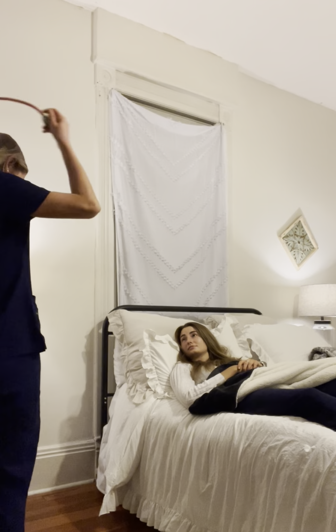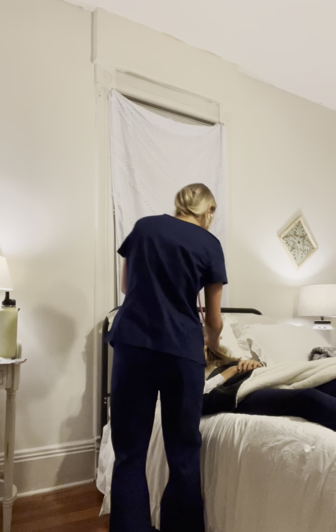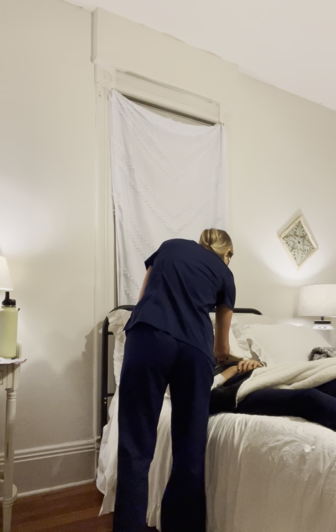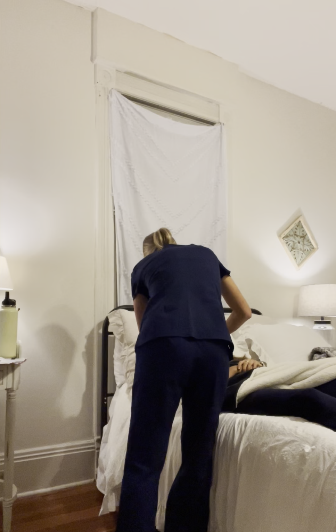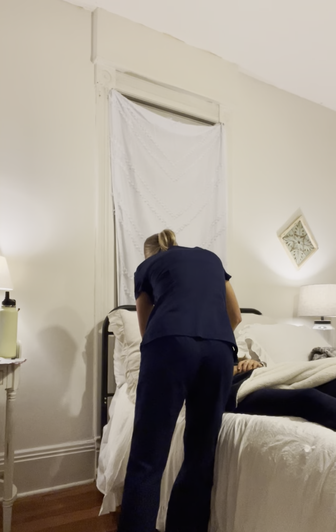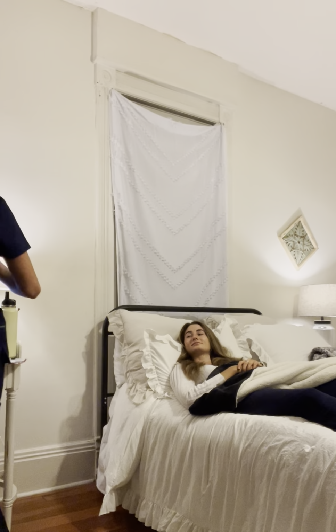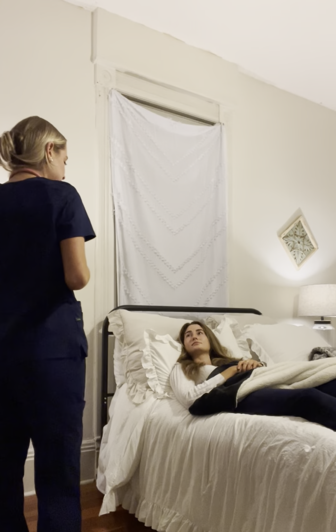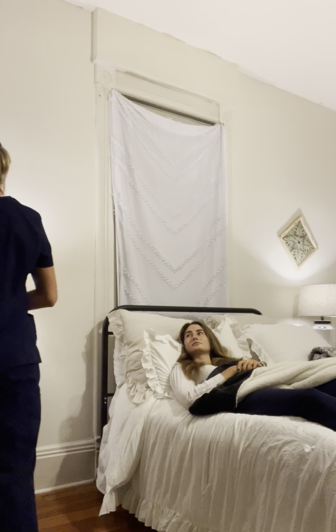And I'm going to auscultate the carotid arteries. Okay, both carotid arteries sound good. No bruit or anything like that detected.